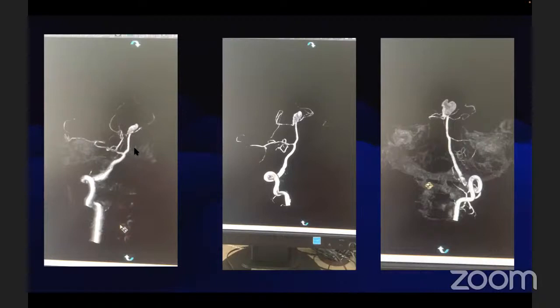So by taking the risk, we waited until the thrombus cleared, and we took follow-up images, which showed on the third day and approximately 2 weeks later in parallel. The aneurysm opened up over a period of 3 weeks, and this is the last image, showing the aneurysm totally opened up.